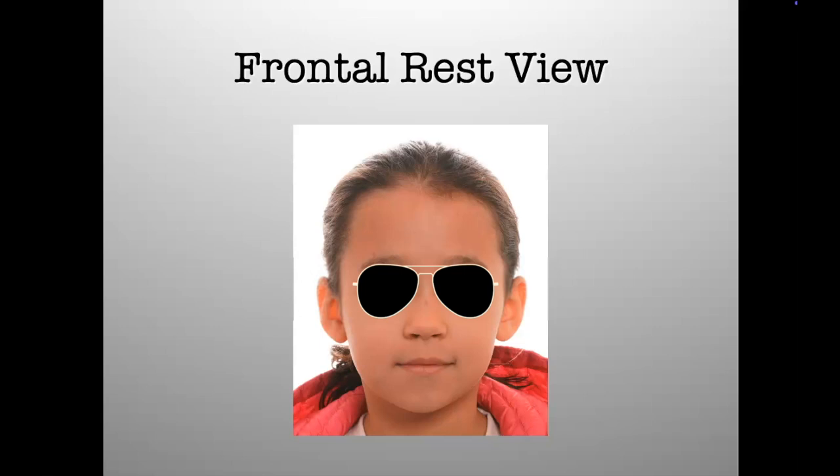Looks good. All right, we've got one vote for looks good. Does everybody vote everything looks good, or does anybody vote anything could be better or maybe looks different? So which side? To the right. Okay, so patient's chin to the right. Do you guys see that?